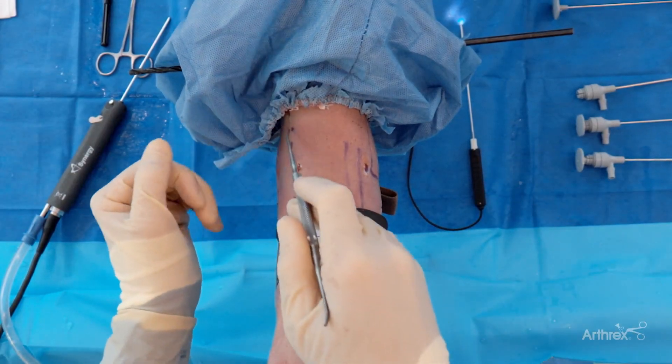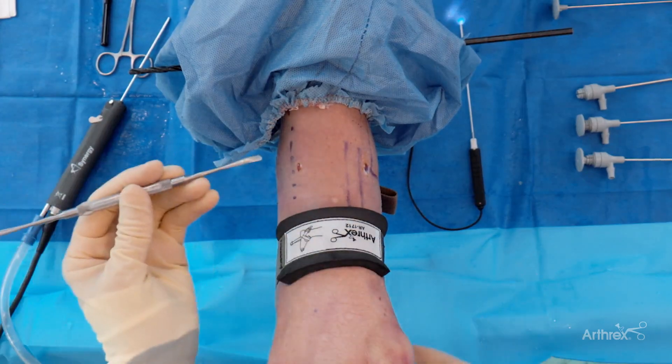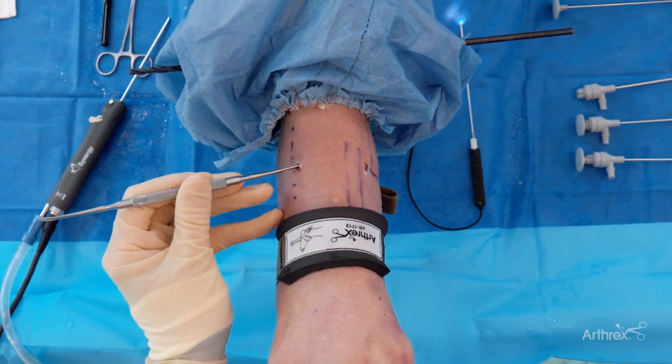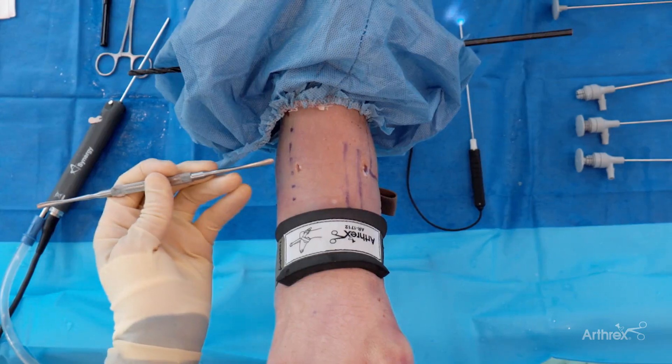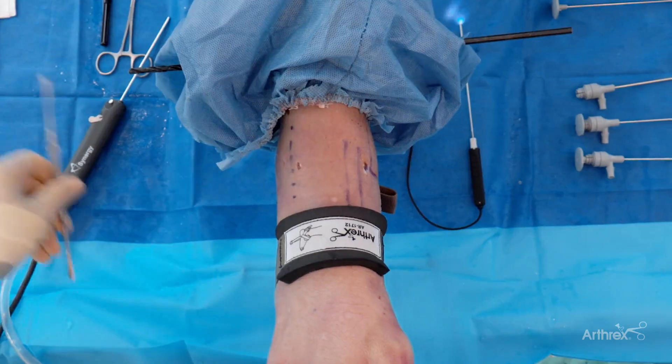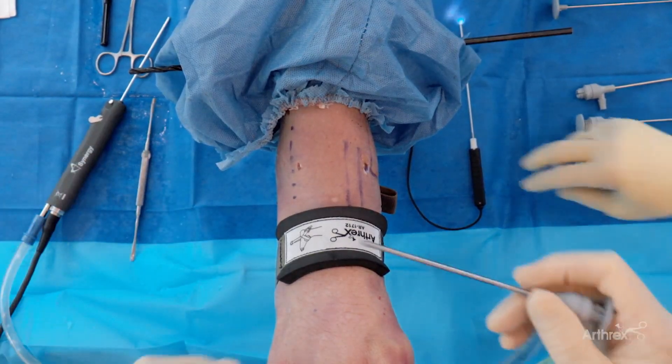I've outlined the superficial peroneal nerve here. We want to avoid that throughout the entirety of our procedure. The anterolateral portal as well, just being able to instrument and do some work. If you need to reach further for other spurs, you can come up even further lateral as well. So there's portal placement — we'll move forward.